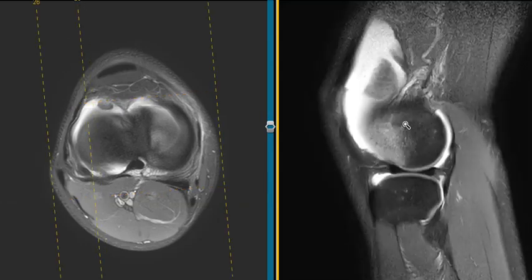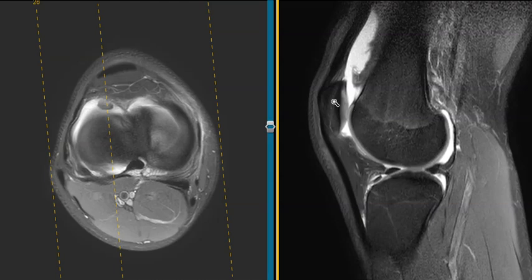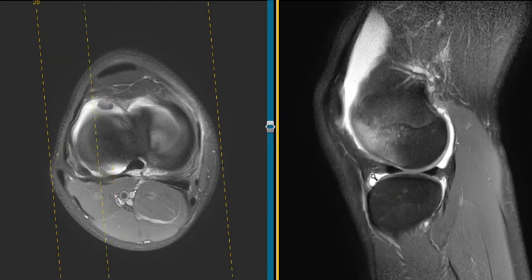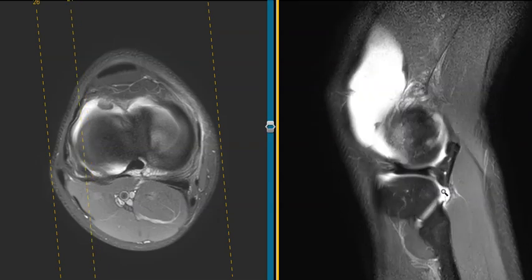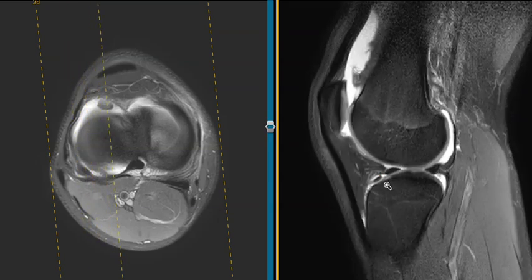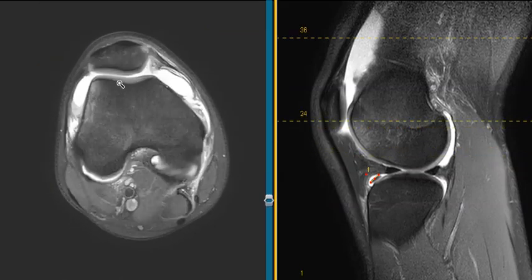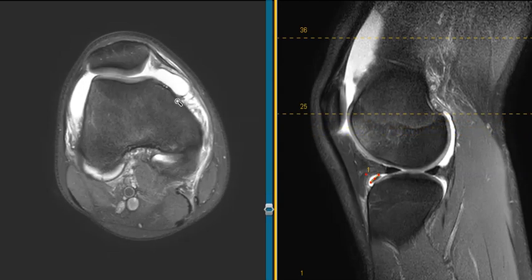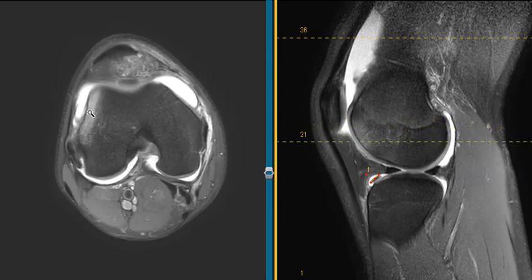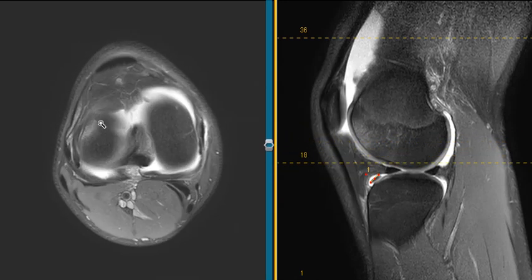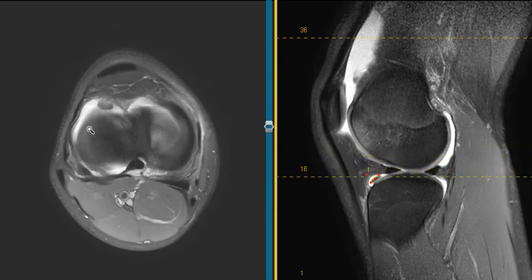We're going to see this on the side view — this is a sagittal view. We see this big bone bruise of the femur. Here's the kneecap, and there's the bone bruise of the femur. Looking for that fragment — and there it is. There's a little displaced fragment. So this is a case of transient patellar dislocation related to a shallow trochlear sulcus, with a tear of the medial patellar retinaculum, a large joint effusion, bone bruise in the lateral femur, and a small articular surface full-thickness chondral defect with a displaced chondral fragment into the anterior joint. And that's it — thank you so much.